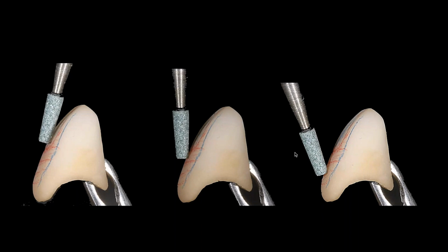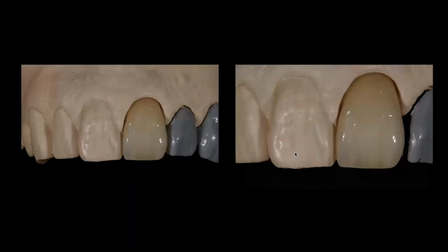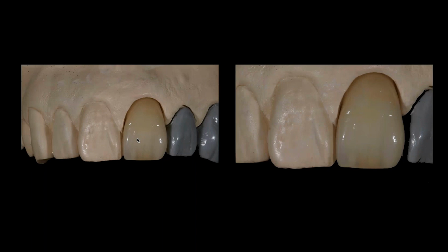And at the end, to make those work, I usually check with a gold or silver powder. And again, on the model, you should notice that the light reflection is pretty similar, right? The ridges, the grooves, the highs and lows. I'm trying to make all those things fall into place and work similar to what I saw in nature. So I think I can walk through these. Let me see.